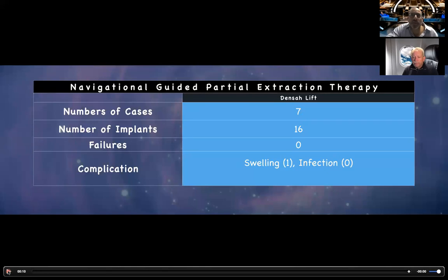And the updates to the software actually have crowns that are prefabricated, a library of crowns that we can open and put right directly into the software and plan based off of a prosthetically driven approach. So beforehand, we used to have to create these wax-ups so we can truly plan it prosthetically driven, as you've lectured on for a few decades already about prosthetically driven implant dentistry. This is a prosthetically driven approach.